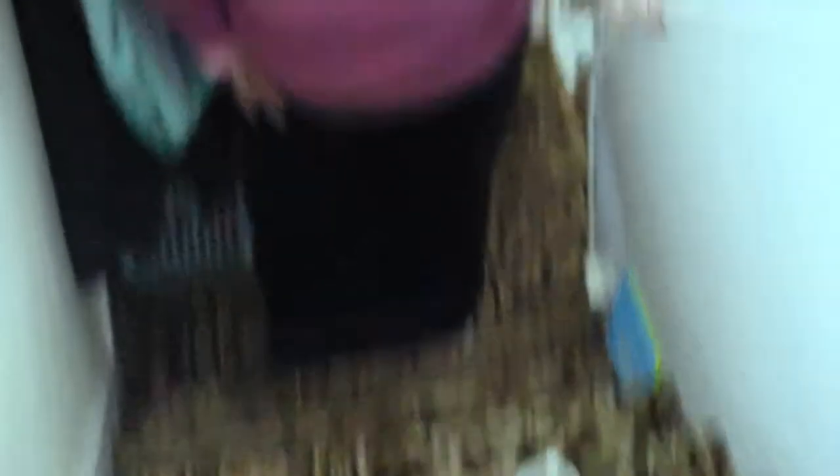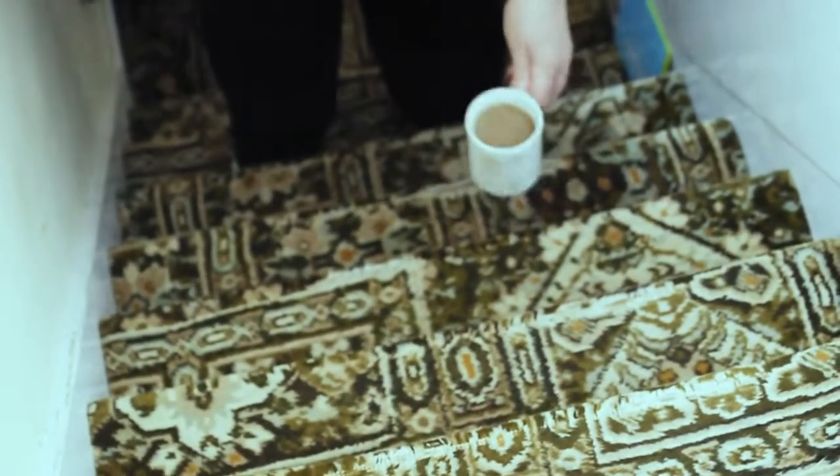Normally when I take the coffee upstairs, I'd put it ahead of me on the stair, then walk up to that stair, then put it on another stair ahead of me and walk up.